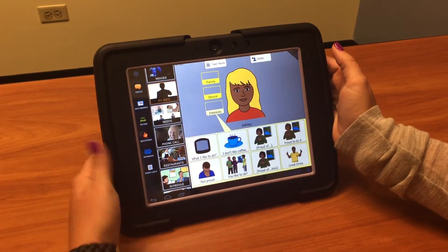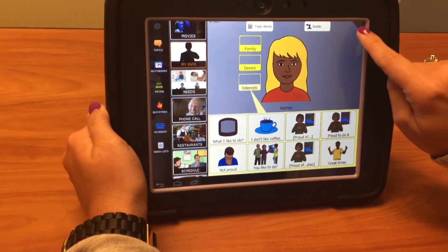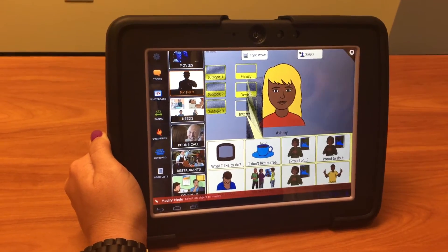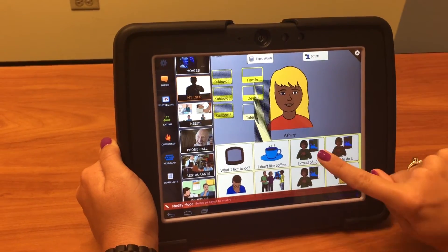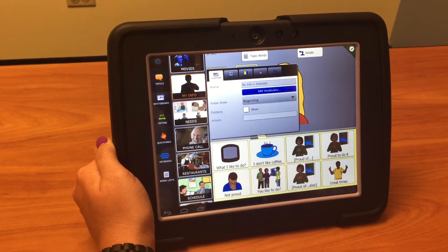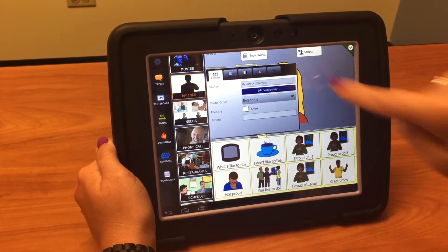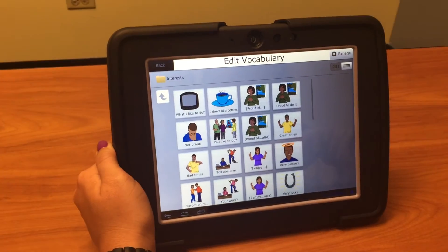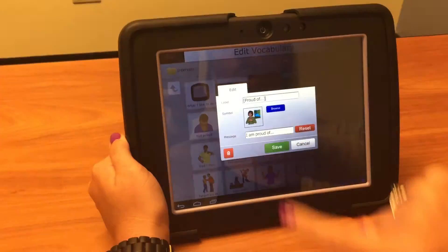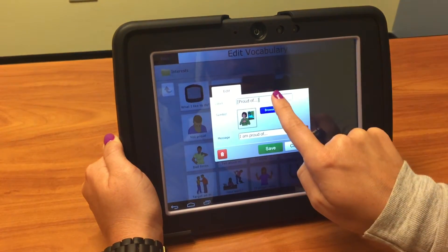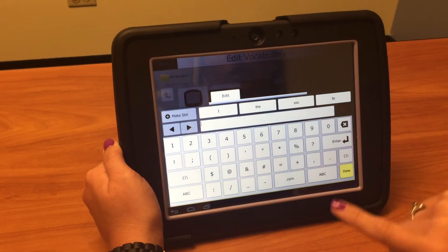Now to program a button, you go into this little corner box triangle. This brings it up to modify mode. You can click the button that you want to modify, click Edit Vocabulary — that brings you to all of the buttons. Choose the button you want to edit and then you can change the message to what you want.